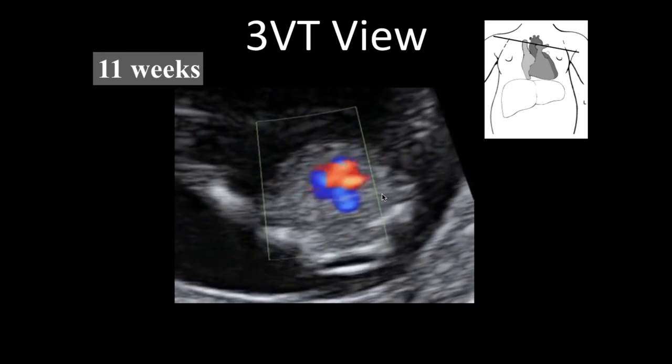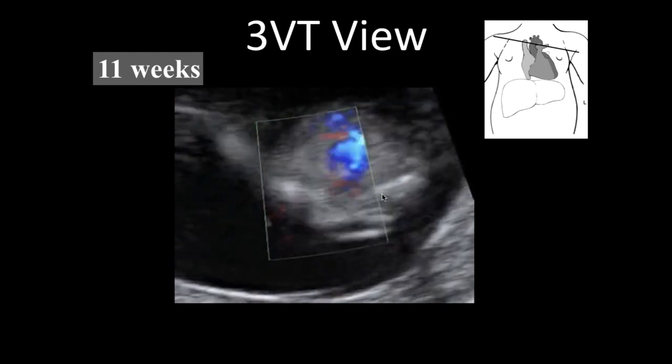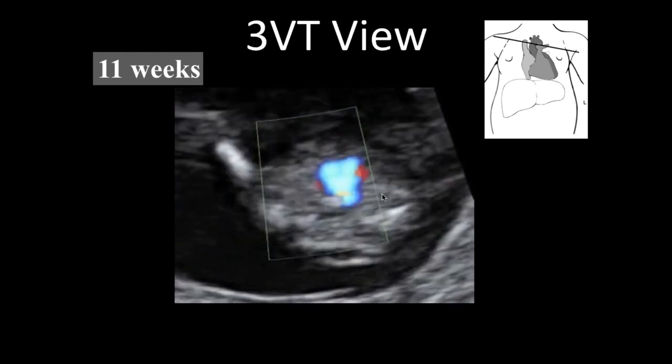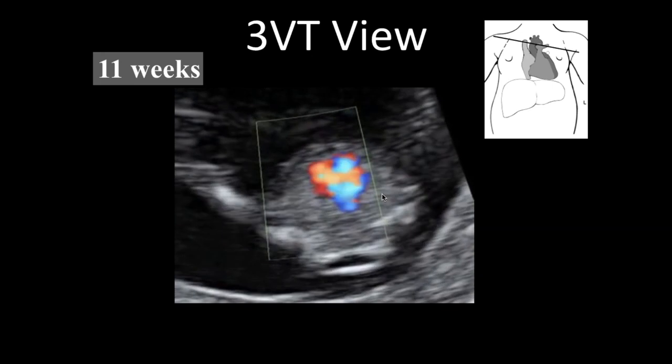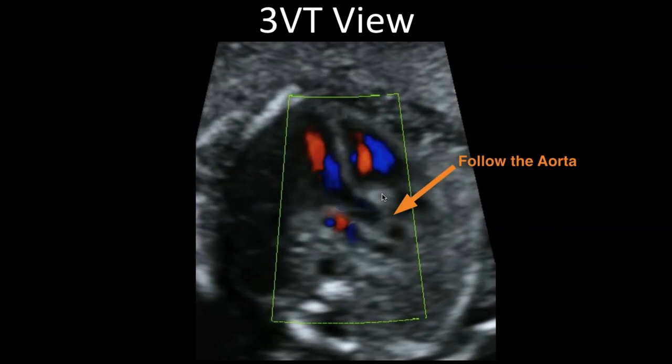Looking at this fetus at 11 weeks, I could tell you that I'm reassured that there are 2 great vessels that are equal in size that have forward flow in them. So I've ruled out a lot of conotruncal anomalies that can be of serious consequences.